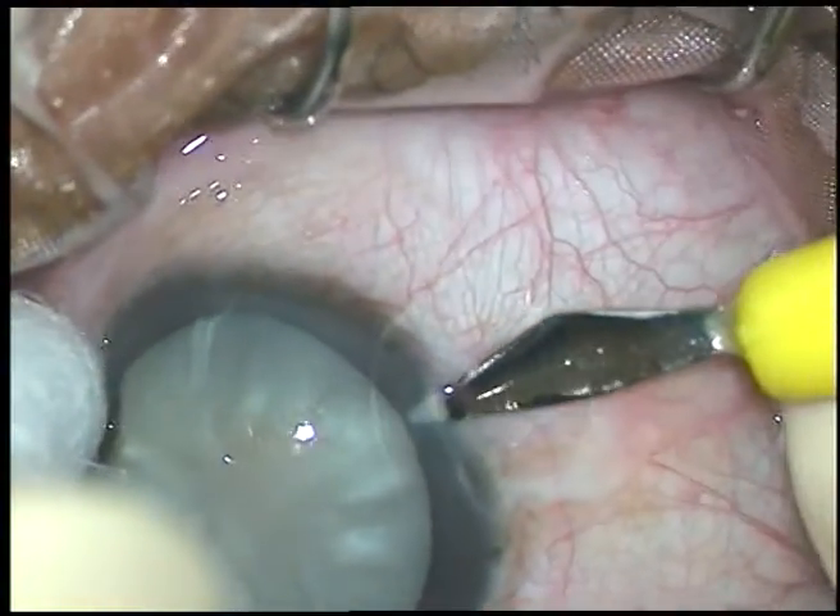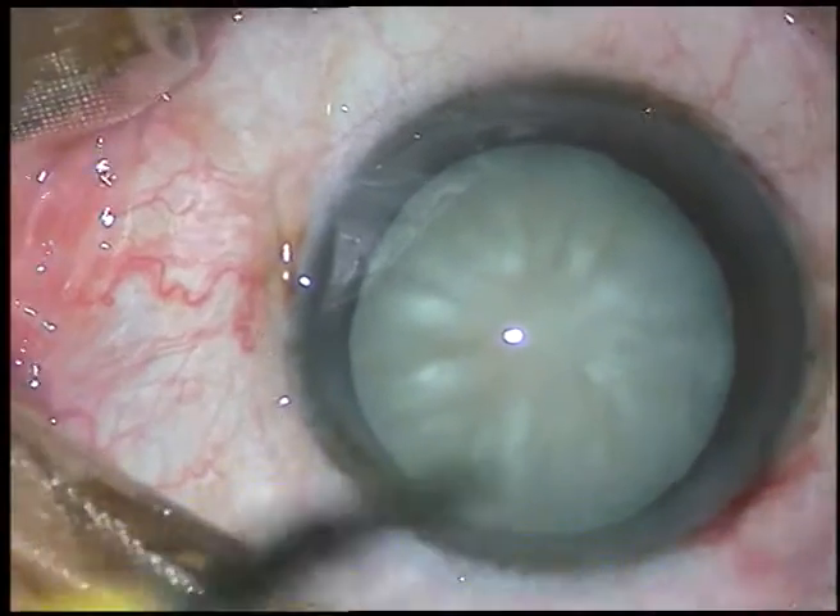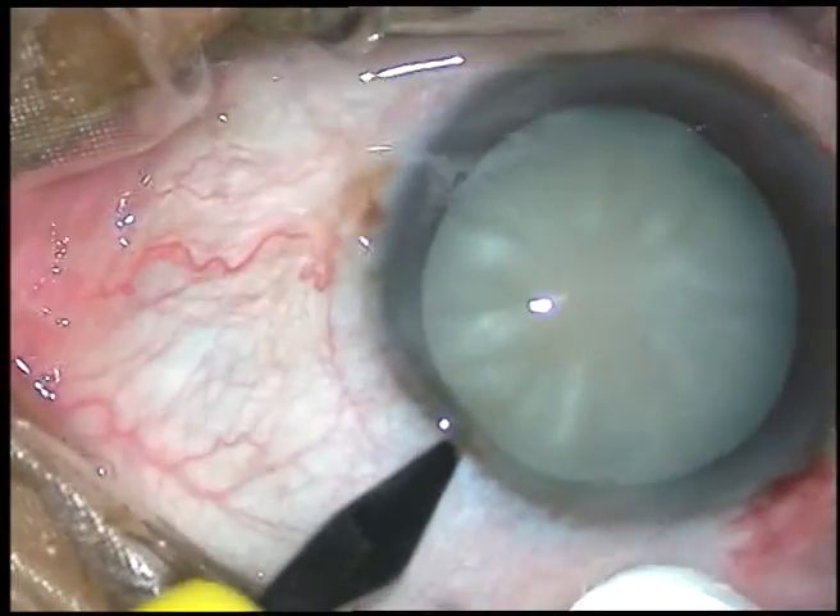Dear colleagues, this is phacoemulsification of an intumescent cataract. I have taken up this case for surgery. Let us observe the surgical steps.